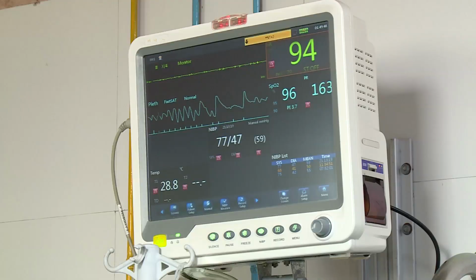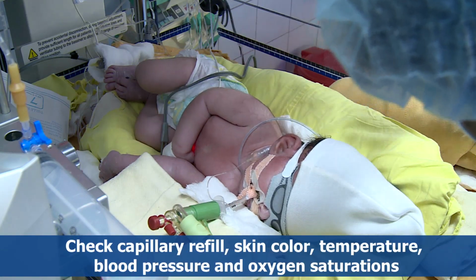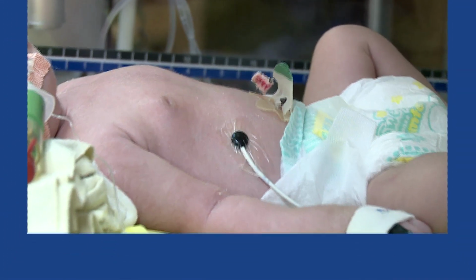Family members should be communicated about the management of the baby. Assess vitals by multi-channel monitor continuously. Check capillary refill, skin color, temperature, blood pressure and oxygen saturations. Continuously monitor and assess the depth of chest wiggle factor.